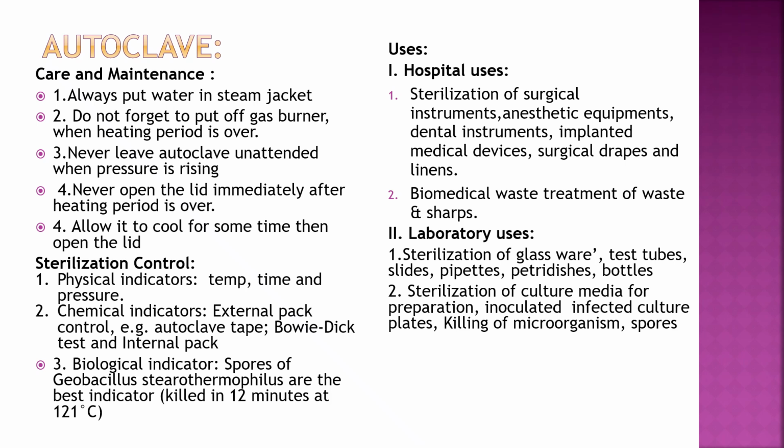In hospital uses: sterilization of surgical instruments, anesthetic equipment, dental instruments, implanted medical devices, surgical drapes and linen, and biomedical waste treatment for disposal. Laboratory uses: sterilization of glassware, test tubes, slides, pipettes, petri dishes used in the laboratory, sterilization of culture media for preparation, inoculated infected culture plates, and killing of microorganisms and spores.